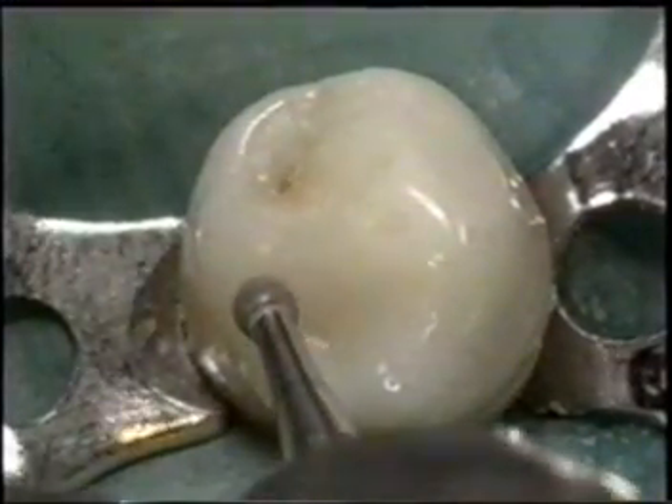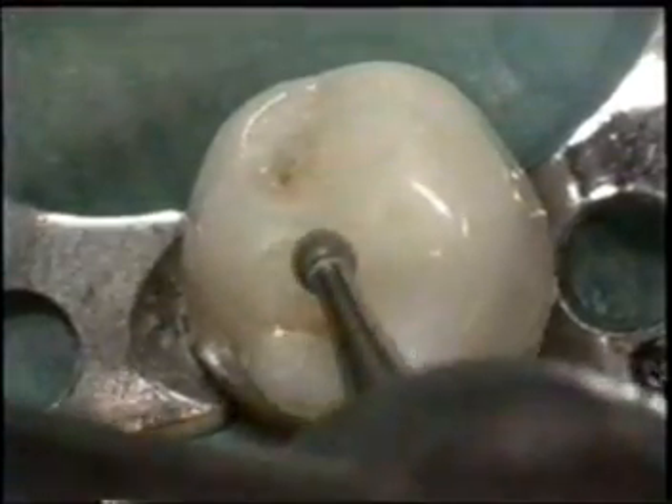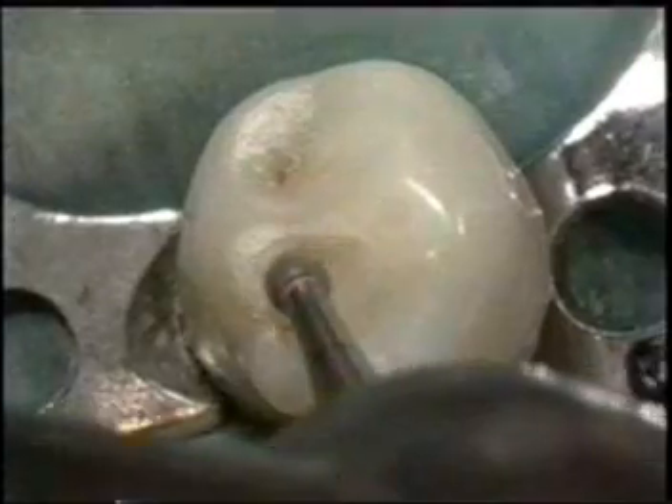Use a high-speed round burr to cut the class 1 cavity, following the outline form through the enamel and dentin until the chamber is penetrated.